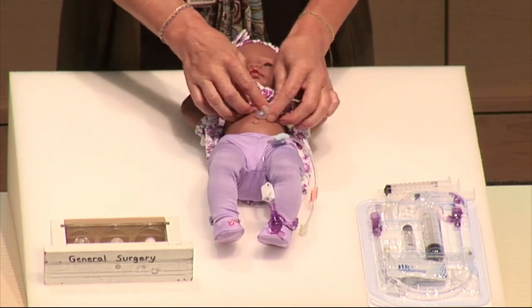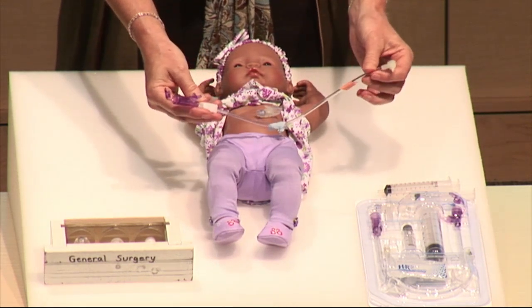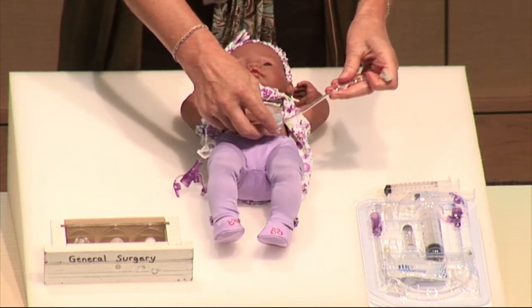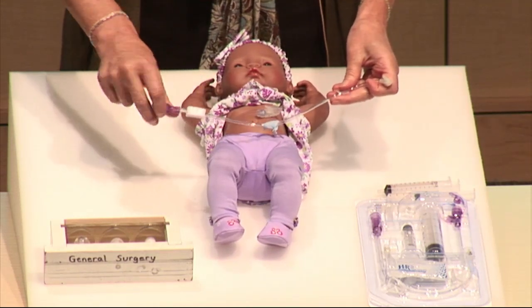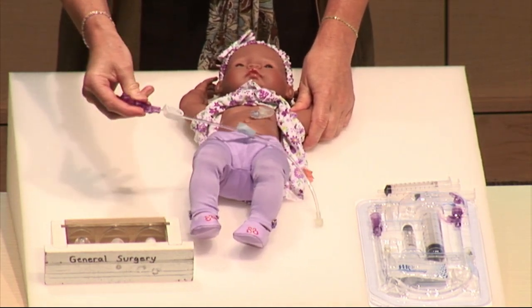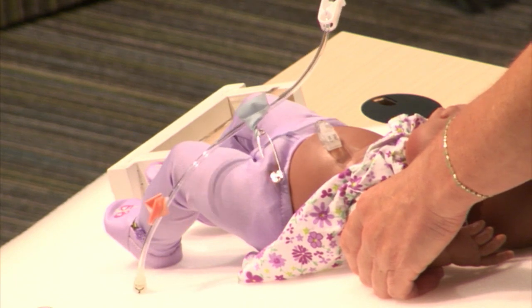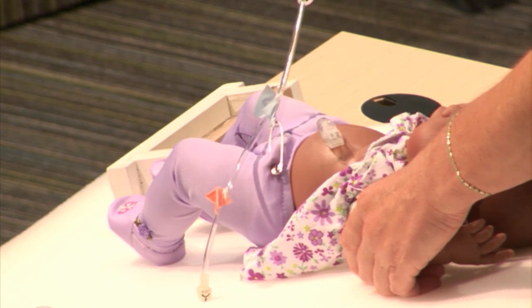That's your normal cleaning. Here is a tape and pin anchor. About 6 inches down the tube, with the clamp above the tape wing, I put a piece of tape and then I attach that to a pin and pin it to the clothing. And then I test my anchor by pulling on the free end of the extension piece to make sure that it's not going to slip or slide. This way, if somebody steps on the tubing or the tubing gets caught in the car seat or the stroller, the big yank is going to hit the pin instead of pulling the tube directly out.